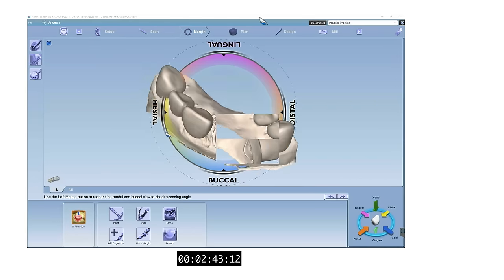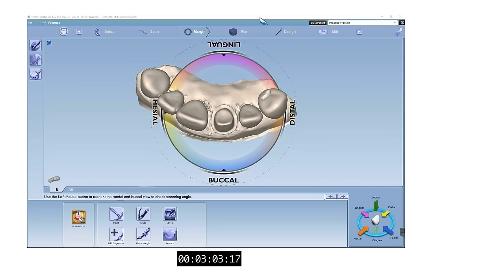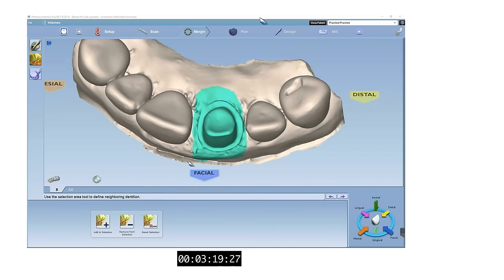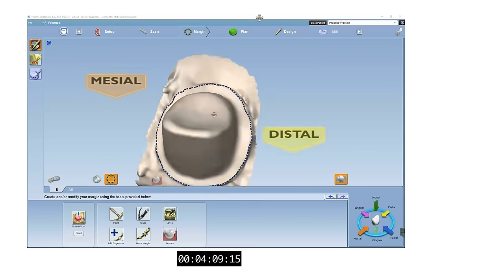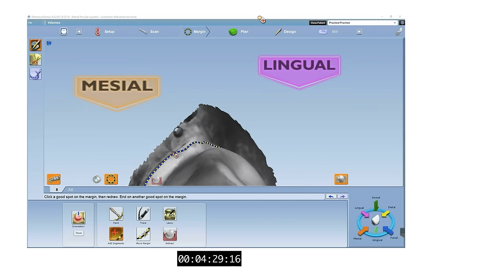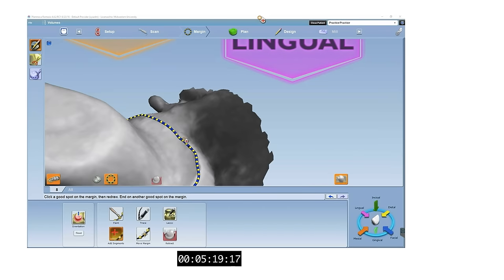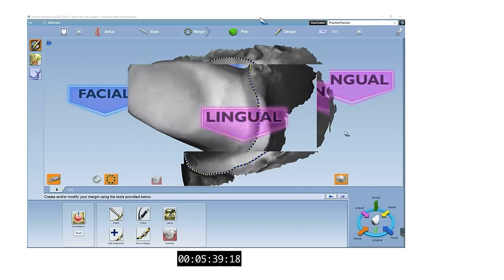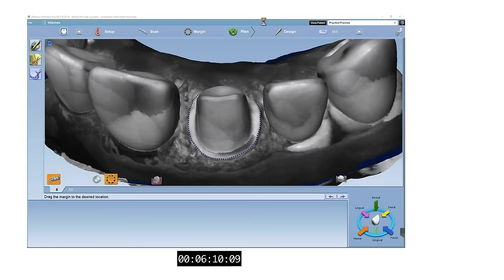Now we can begin to denote our margin. We can start by defining the orientation of our prepped arch. Next, we will digitally trim our die like a technician would for a lab-made crown. I like to use the paint tool to get a preliminary trace of the margin and then refine it using the add segment tool. Rotate the die to verify your margin from different angles. You can see that the incisal edge looks sharp and not rounded like it should be — keep that in mind as this will lead to issues further along in the design process.